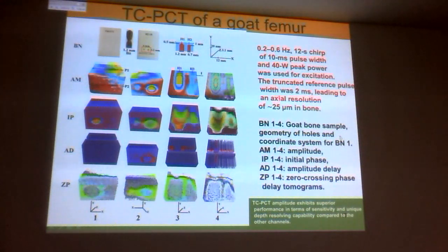So we set the parameters, and what this feature is doing, as I said, is that instead of having the entire signal coming in over the total length of time, the correlation integral going from minus infinity to plus infinity, we chopped the correlation integral for very short times.